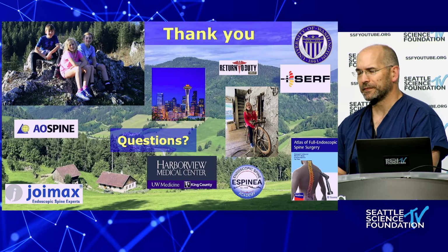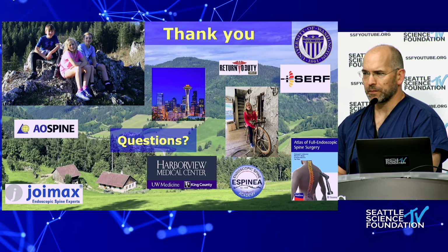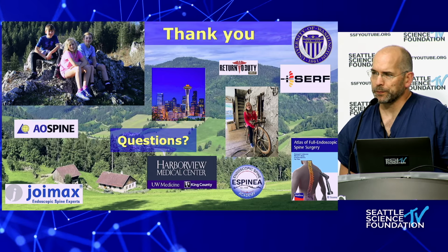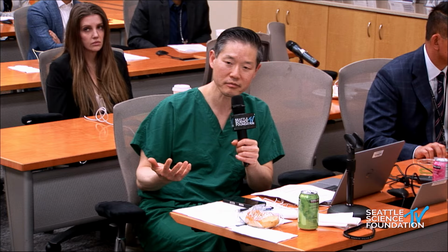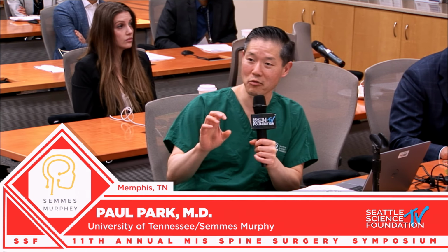That's great, Christoph. I'm always impressed when I see these presentations, because obviously if you can do something through a very small working channel portal, it's obviously better for the patient. I guess when it comes to cervical spine, people are always at a little bit higher threshold. And I'll ask the same question: bigger patients, I do foraminotomies, and I typically use a tube, honestly. And I struggle sometimes with localization, but I think you have more leeway in a tube versus endoscopic, because you can move it around a little bit more. You see a little bit more of the surrounding anatomy. I mean, is that an issue for you guys?